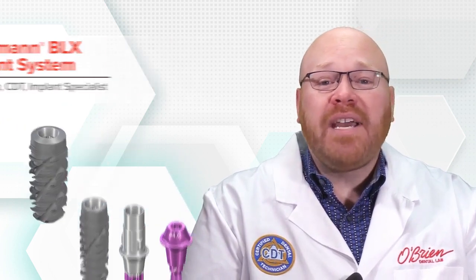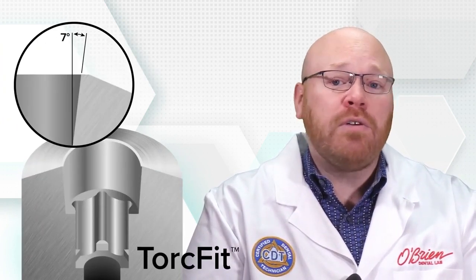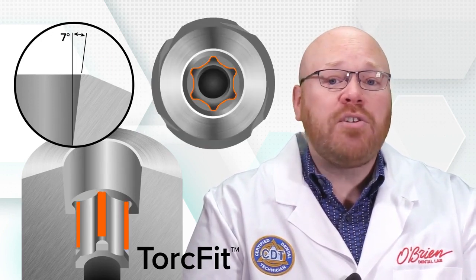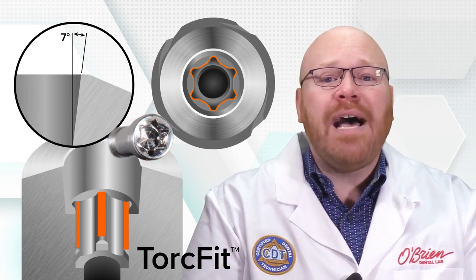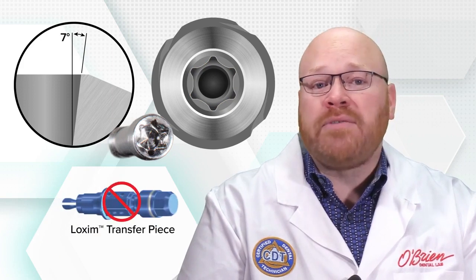This is a completely new system with a connection that's unique from any of their previous offerings. The connection is called TorcFit and it features a 7 degree internal cone with a star shaped anti-rotation element. This star shape is the same design found in the head of the Straumann screws and it allows for greater torque transmission, which eliminates the need for a Loxim transfer mount.